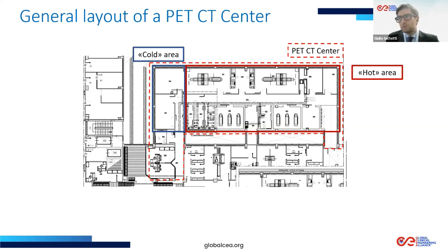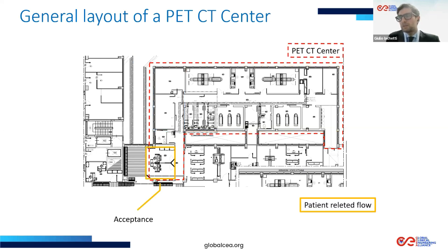In the cold area, you don't have any lightly radioactive people who have been injected. In the second one, you have injected patients. And in general, you have different activities that you can do in the cold area and in the hot area, and different kinds of safety actions that are permitted.